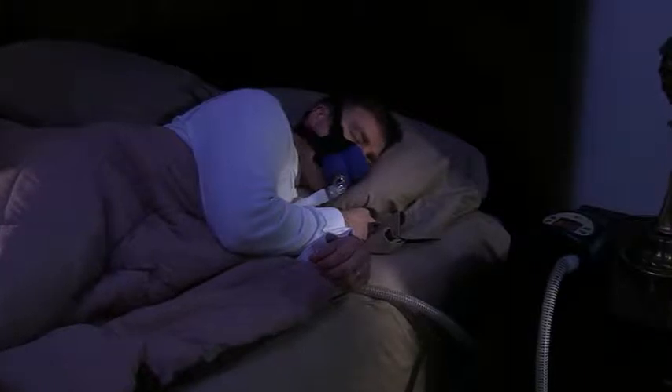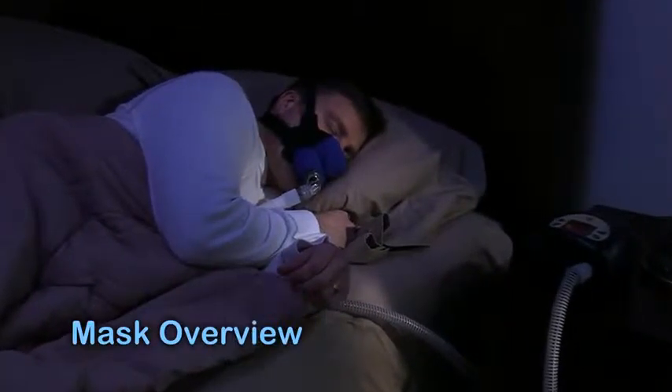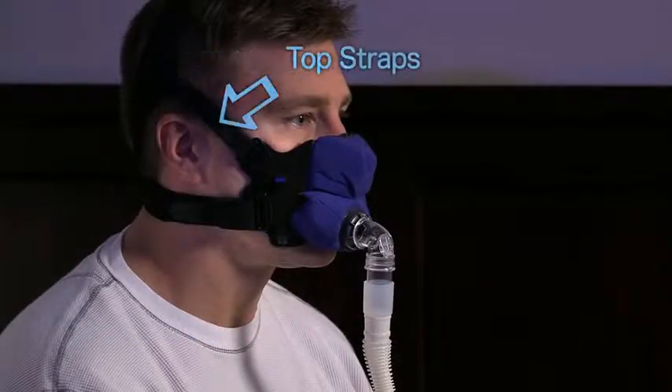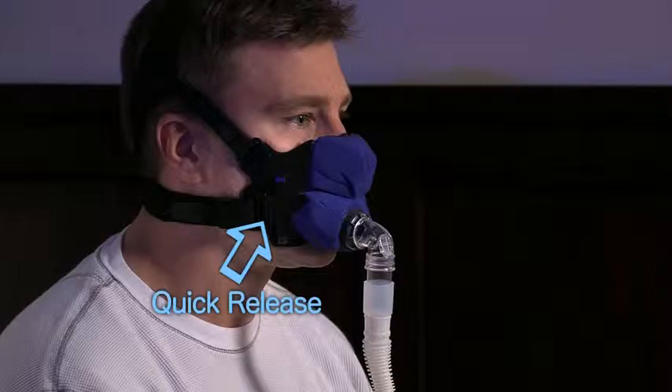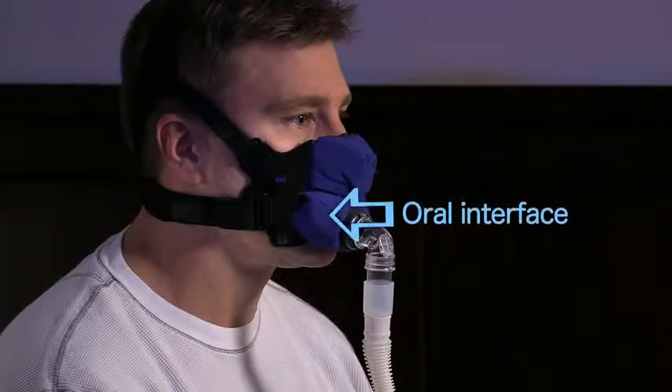Thank you for choosing the SleepWeaver Anew, a soft cloth full face PAP mask. Your new mask and headgear comes in small, regular, and large sizes and is ready to use right out of the box. It is important to understand the size and orientation of your mask.